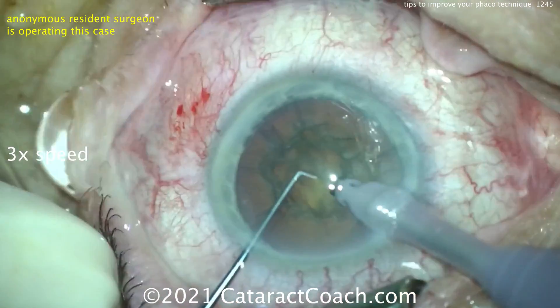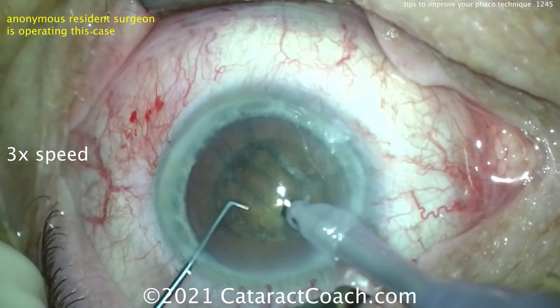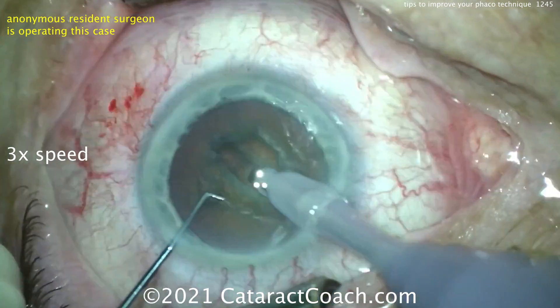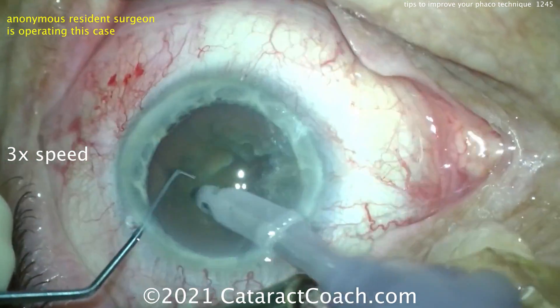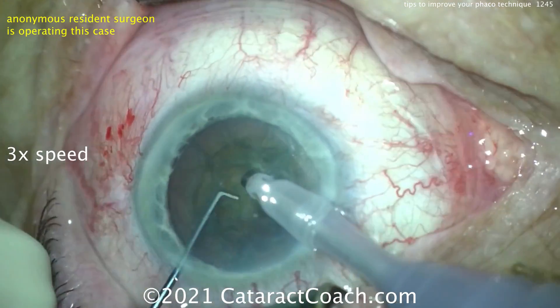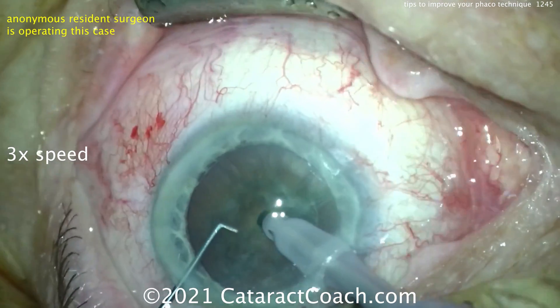Keep that back in primary. Keep in mind that's a baby rhexis, so don't damage the rhexis edge. Groove down the middle — okay, I'll take that. Look at the Purkinje images — just try to keep them in the center of the cornea. You want to keep this eye centered up. There's a good crack — I'll take that — and rotating 180.